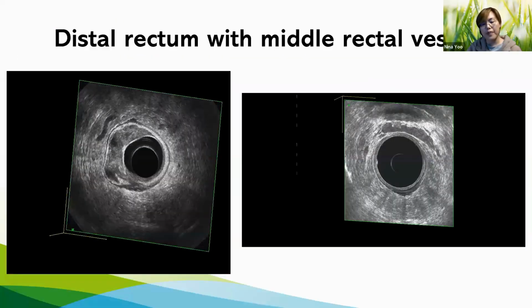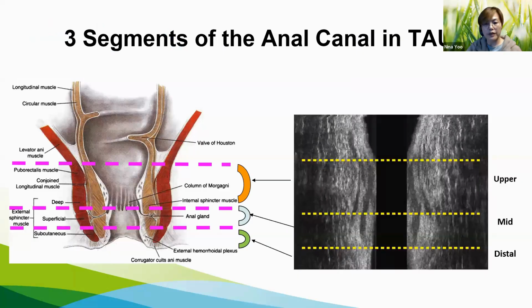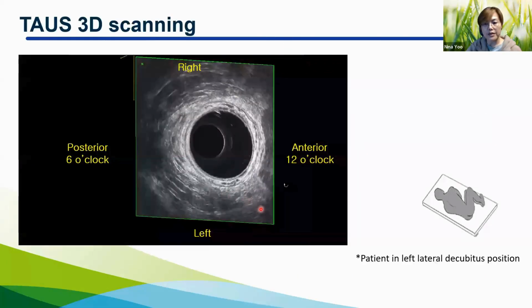Well, so far I've talked about how the transrectal ultrasound is good for rectal cancer diagnosis. Now, moving on to the transanal ultrasound. Well, this is an example of a 3D scan by transanal ultrasound.